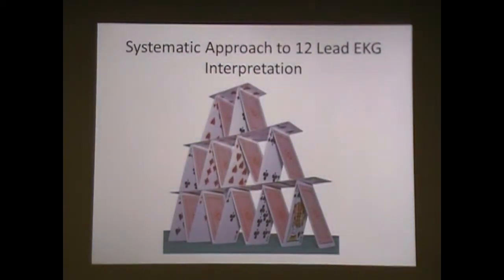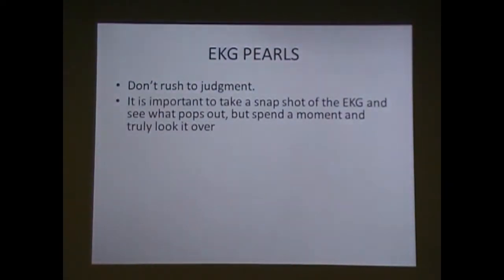Systematic approach to 12-lead EKG interpretation. Pearls: don't rush to judgment. We all see things that jump out and we focus on that, and then we can miss stuff. It's important to take a snapshot and see what does pop out.